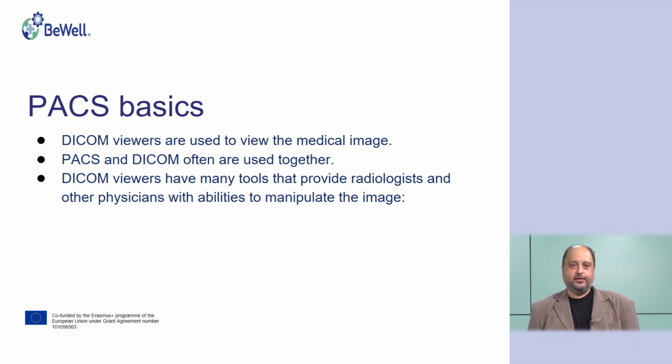The DICOM viewers are used to view the medical image, and PACS and DICOM often are used together, DICOM viewers of course. They have many tools that provide radiologists with ability to manipulate the image, and in this sense manipulate is not something to use as something to deceive or something in bad meaning. Manipulate means just to process the image in such a way to have it better, to easy understand.